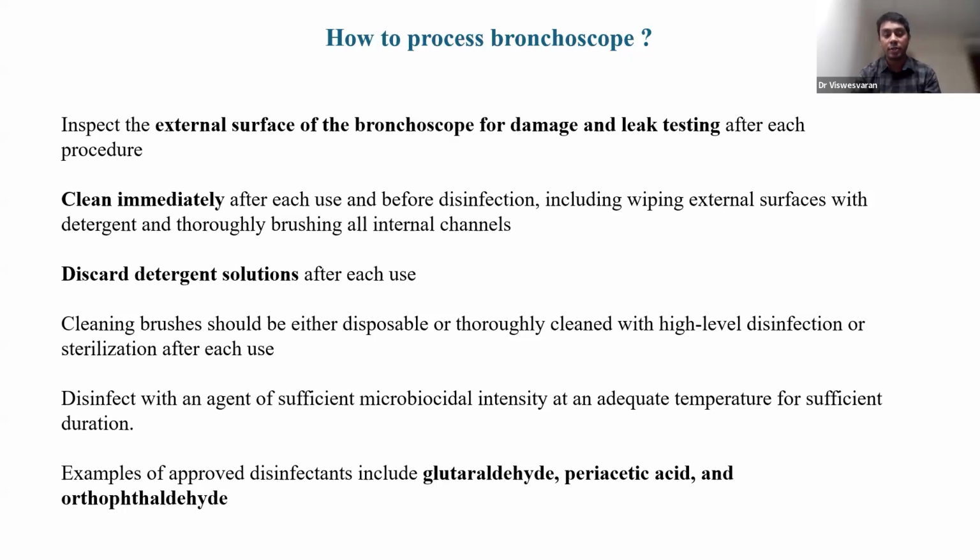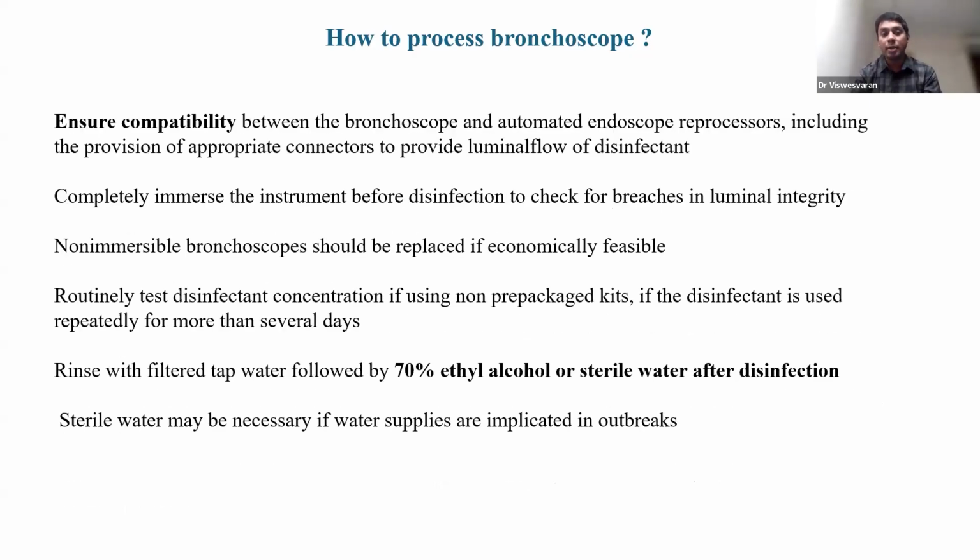The preferred disinfectants include glutaraldehyde, peracetic acid, and orthophthalaldehyde, and ensure compatibility between the scope and the endoscope reprocessing processes. This is also very important because you need to follow the manufacturer guidelines. Sometimes you may be using a non-compatible scope, which can compromise the credibility of disinfection of these scopes. And completely immerse the instrument before disinfection to check for breaches in the luminal integrity.